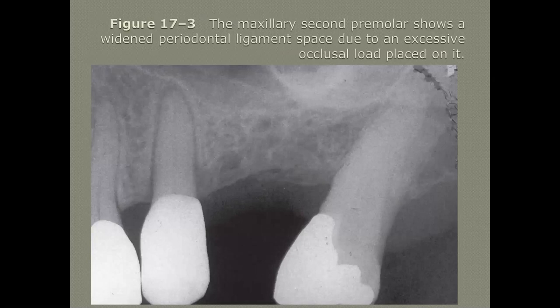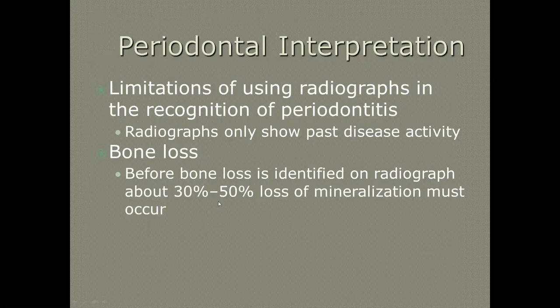This radiograph shows no bone loss, but with the way the premolar is tipped it looks like there might be. This is a maxillary second premolar showing a widened PDL, indicating some sort of occlusal discrepancy. You can see the widened PDL along the entire tooth and also on the first premolar. Some limitations of radiographic interpretation: it only shows us past degree of disease activity, and you need that 30 to 50% loss of mineralization for it to show up — that's always a test question.